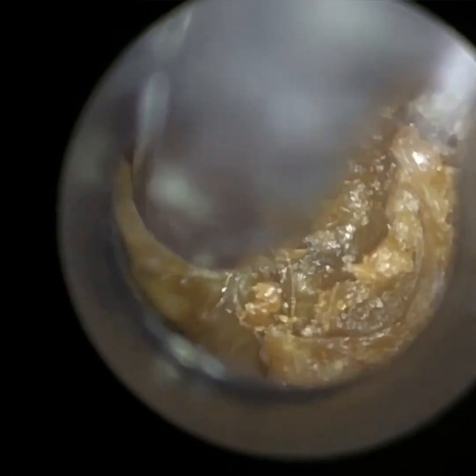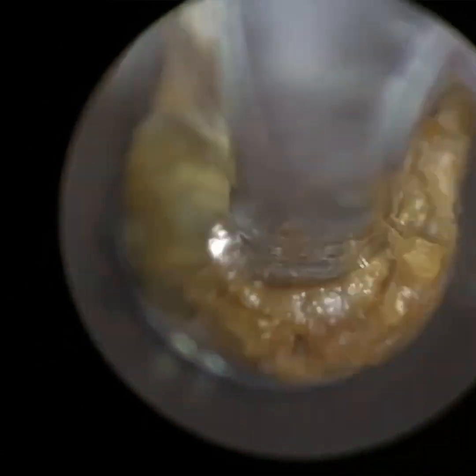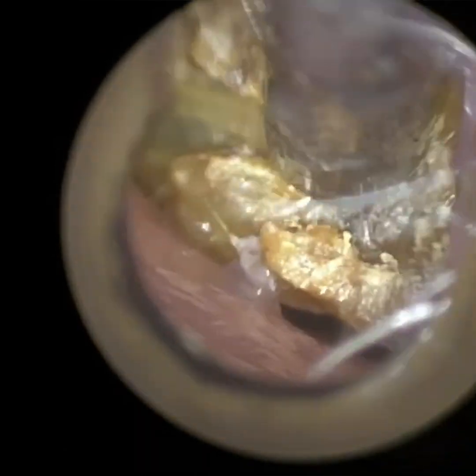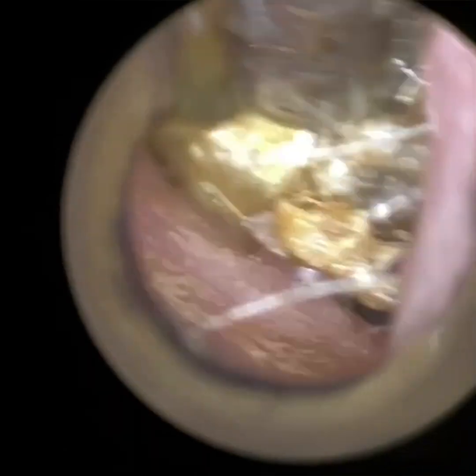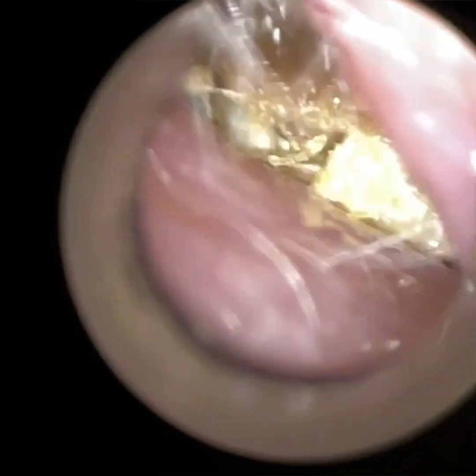An ENT microscope is also very difficult to train someone to use, because you have to acquire binocular stereoscopic vision — you see the wax in 3D. When people first use a binocular ENT operating microscope, they often get double vision — two images of the ear — and you almost have to train your brain to merge those two images. Of course, ENT operating microscopes are also very expensive and not portable, which is why headworn microscopes and loops have become more popular.